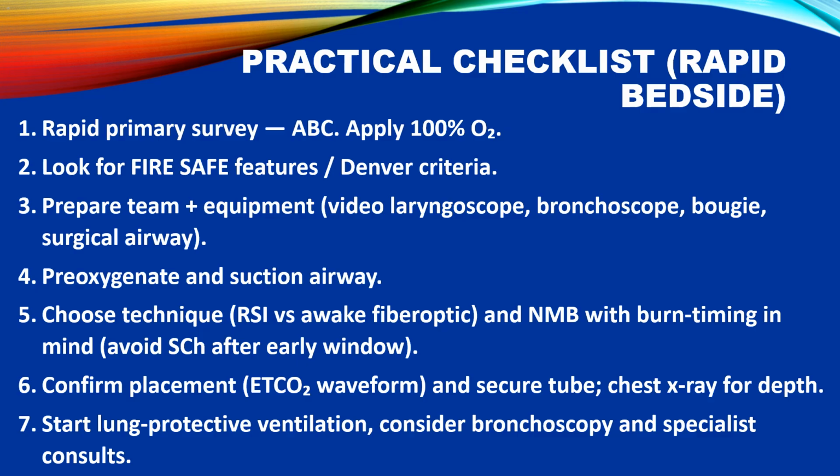4. Pre-intubation preparation. Pre-oxygenation. Pre-oxygenate the patient to increase oxygen reserves. Suction airway. Suction the airway to clear debris and secretions. 5. Intubation technique. Choose the intubation technique, considering RSI or awake fiberoptic intubation. NMB consideration. Consider the timing of neuromuscular blockade, NMB, and avoid succinylcholine after the early window.